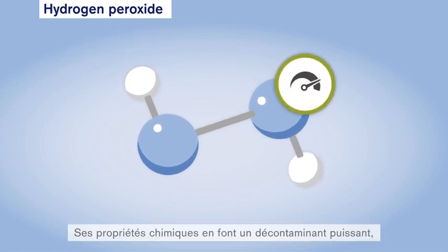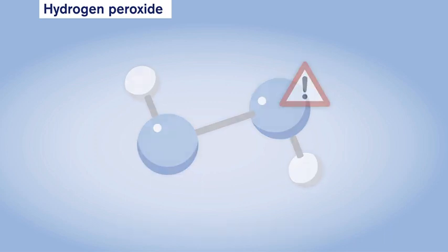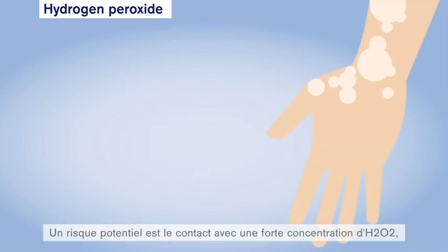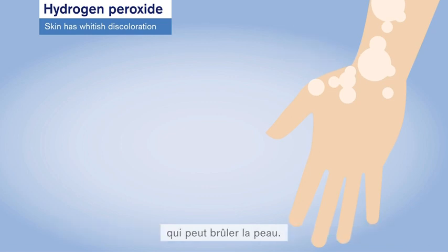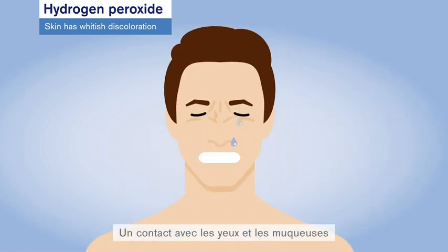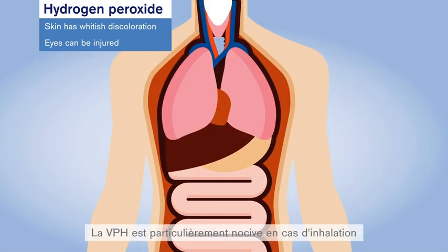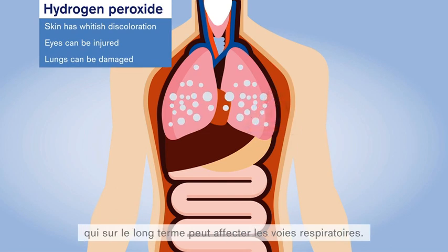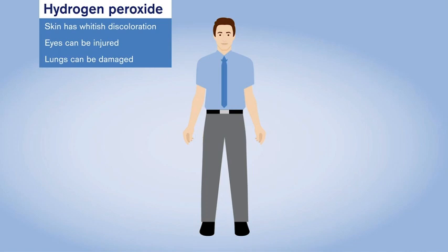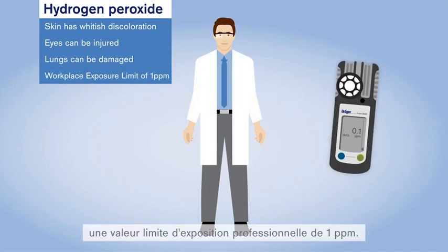H2O2's chemical properties make it a powerful decontaminant, but also carry risks. One potential risk is that contact with increased concentration levels of H2O2 can lead to skin burns. Contact with eyes and mucous membranes can even lead to permanent tissue damage. And hydrogen peroxide is particularly harmful when inhaled as a vapour and leads to long-term damage to the respiratory organs. That's why many countries impose a strict occupational exposure limit of 1 ppm.